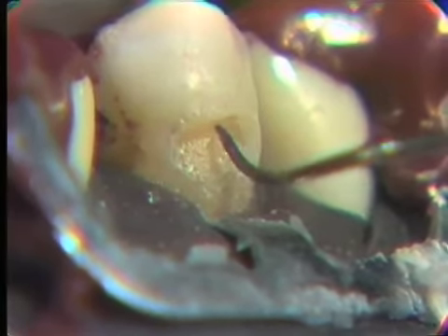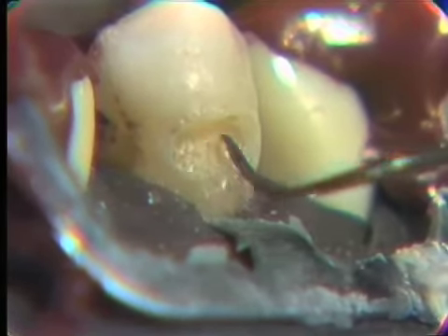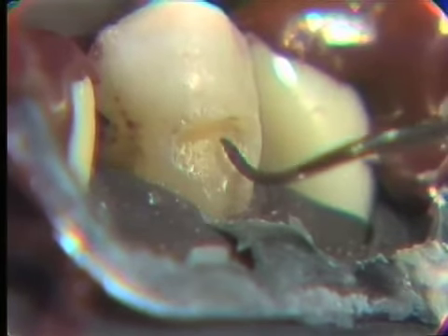What we are looking for then is, again, a groove going along that occlusal wall that we can feel with our explorer, like so. We're actually feeling that groove. Now, it may be somewhat difficult for you to see it, but then our cues in these operations are visual and tactile. In many cases, your tactile sense will be more acute than your visual sense in determining if you have enough retention.